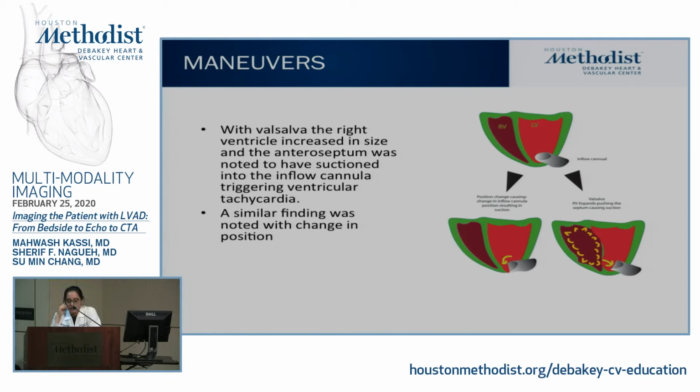Some people are very stringent about that definition, the presence of VT and dizziness, and I kind of disagree with that, because we've missed a lot of patients with suction because we said, okay, they didn't have VT, or they're not having any symptoms or speed drops. It can be a very transient issue that happens for less than 3 seconds, let's say, and then goes away. But I think the most important part is imaging to tell you if there's suction or not.